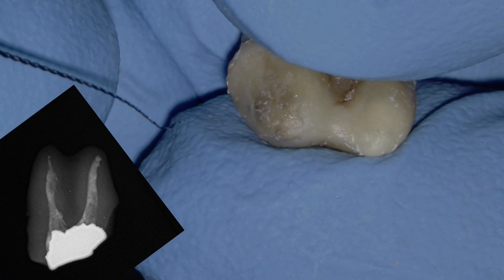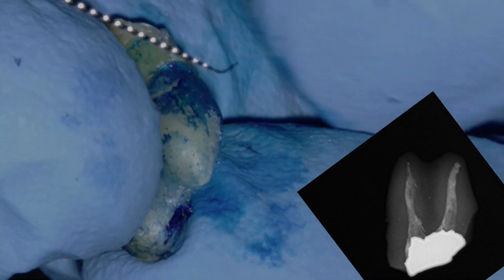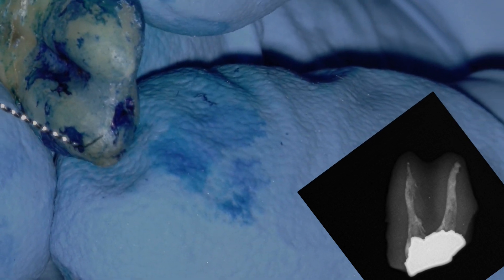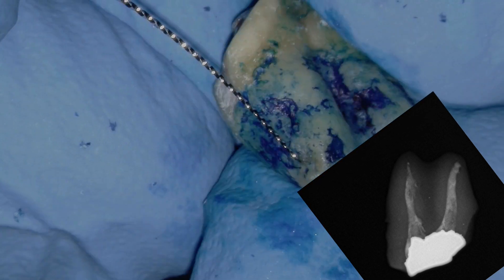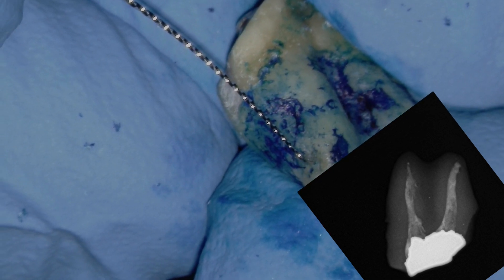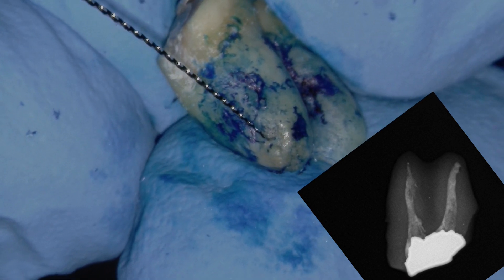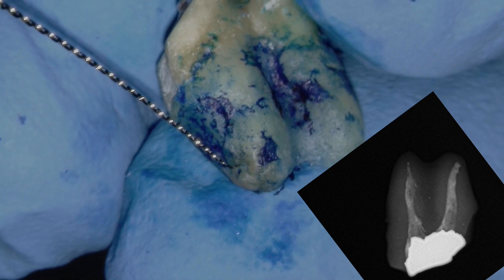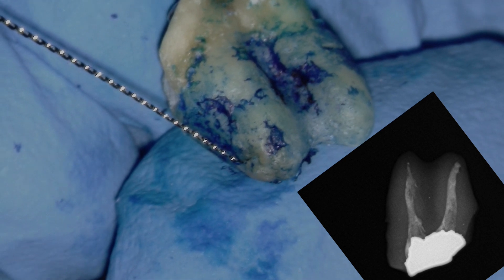Ironically. So next what we're going to do is stain the root surface with methylene blue dye, and it may help to see if we have a portal of exit on that buccal root surface — short of having a micro CT in my back pocket, which I don't carry around in my minivan. We're going to go old-school visualization. That's a C-plus file number 8 in my hand, and there — that is where the portal of exit is that you can see. The point I wanted to show is that I think there is actually a lot of truth to what Dr. Ricucci is talking about: maintaining your filling and obturated material within the canal will lead to success in your root canal.